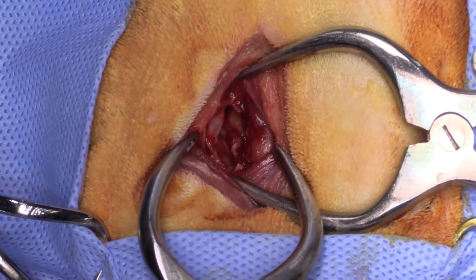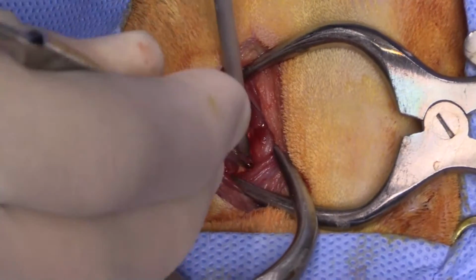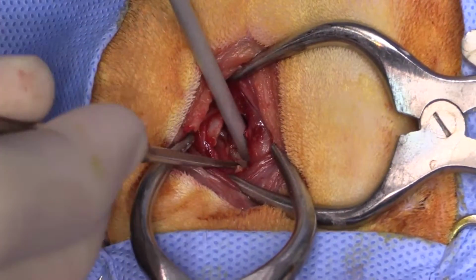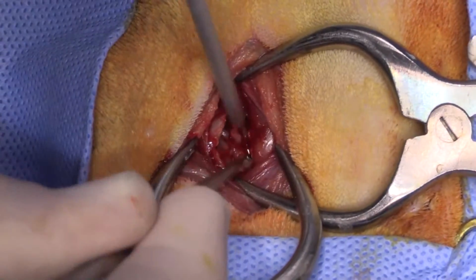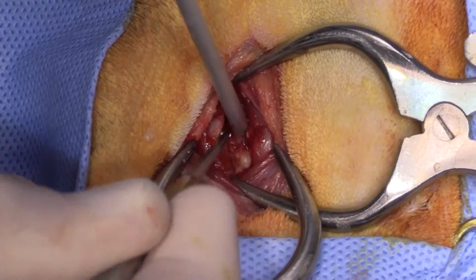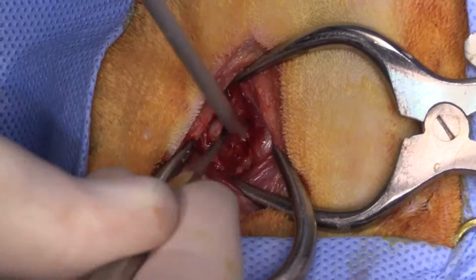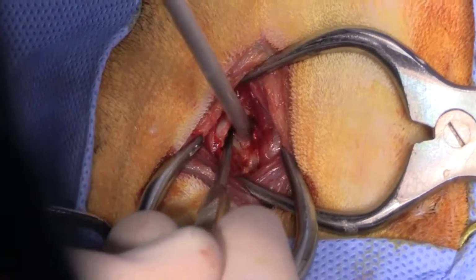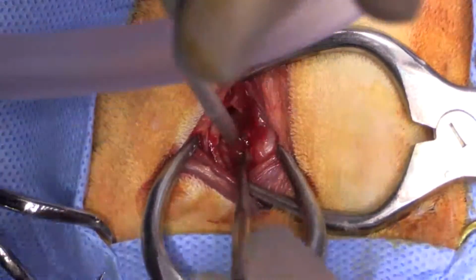And again, there's less that we can damage in the ventral medial compartment than there is in the dorsal lateral. So I'm just scooping out all of the polypoid material. I can see it actually traveling through the eustachian tube here. So I think that the other side is just mucus in it secondary to the obstruction of the eustachian tube by the inflammatory polyp, whereas this is the one where the polyp actually originated from. So I'm just scraping out all of that polypoid tissue.